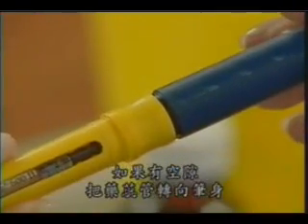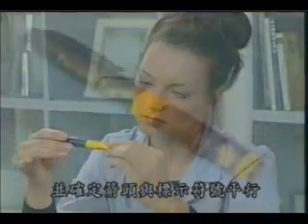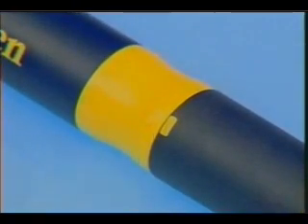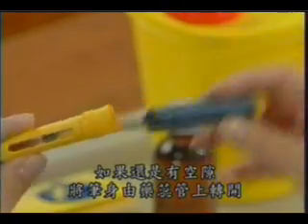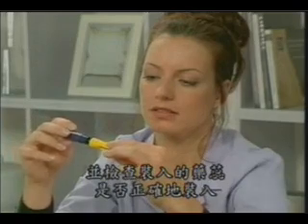If there is space, screw the cartridge holder towards the body, making sure that the arrow falls within the aligned mark. If there is still a gap left, unscrew the body from the cartridge holder and check whether the cartridge has been inserted correctly.